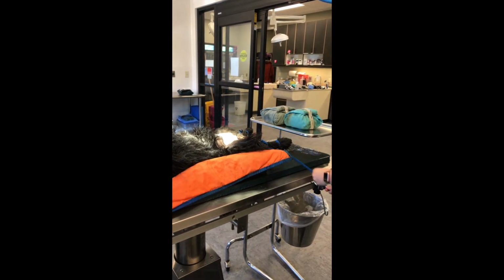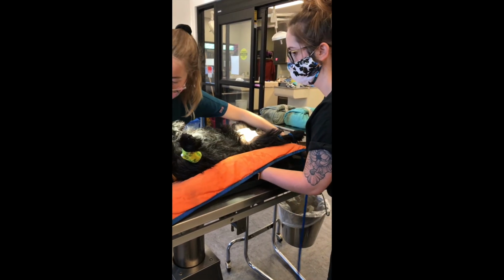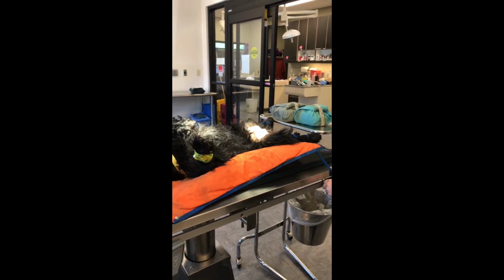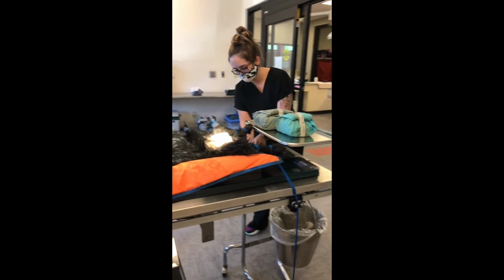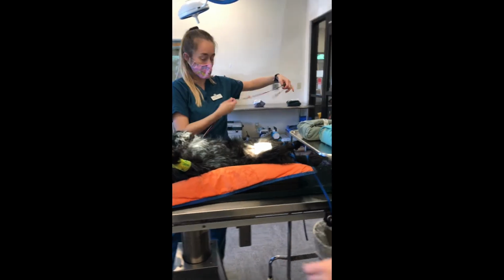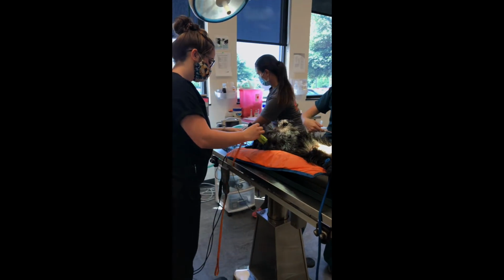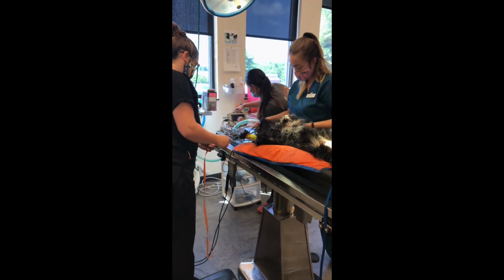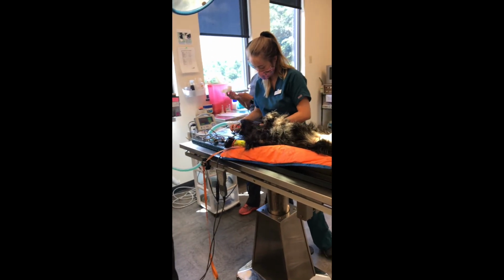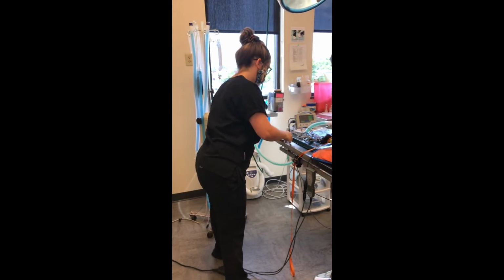You want to move him down, Kristen. All the way down here. The whole thing down. Yeah. Yep, perfect. And 110.